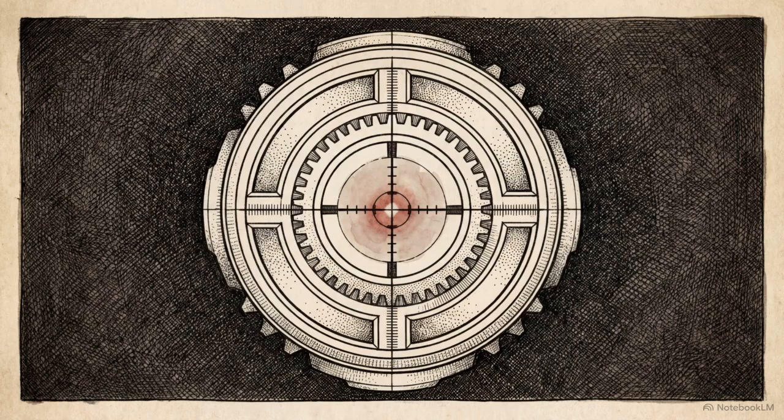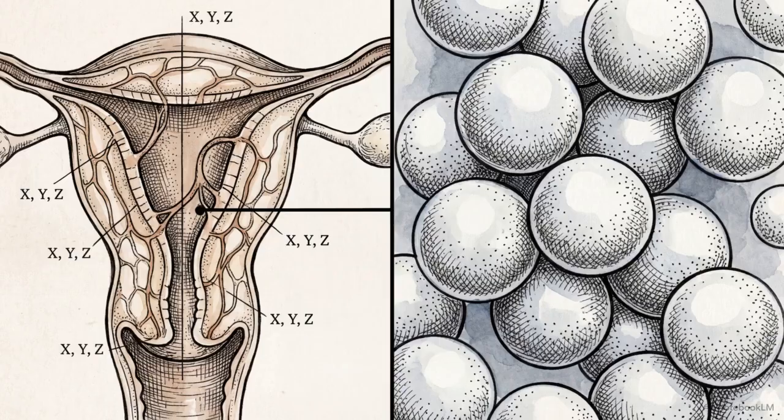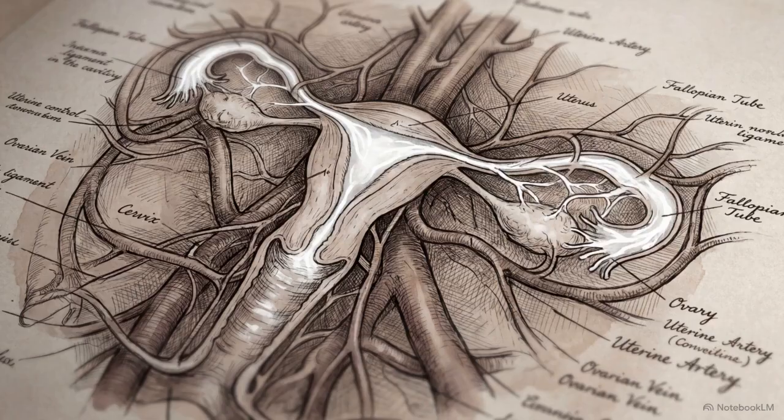UAE is a highly calculated mechanical strike. It relies entirely on matching a specific physical weapon to the tumor's exact coordinate location and its cellular vascularity. Navigating the internal reproductive lumens requires abandoning the strategy of occlusion to focus entirely on mapping and unblocking structural pathways.